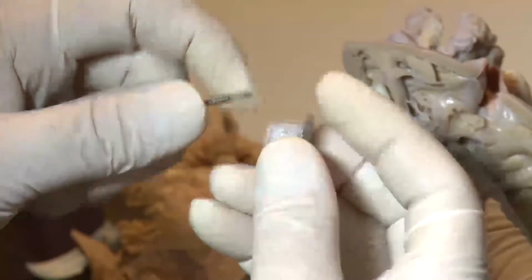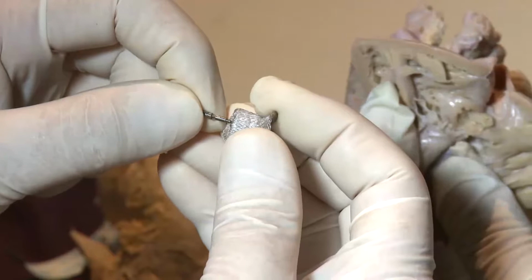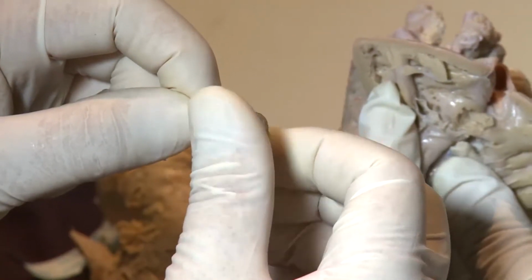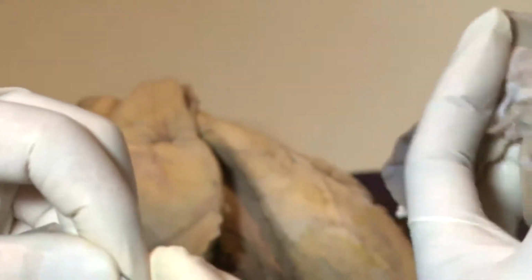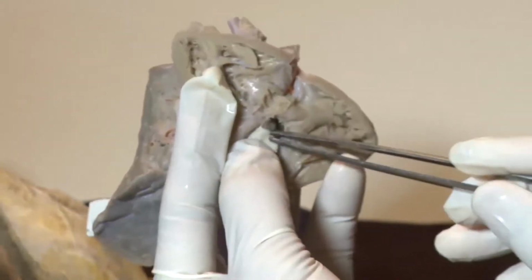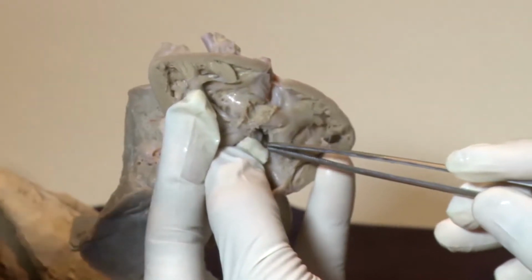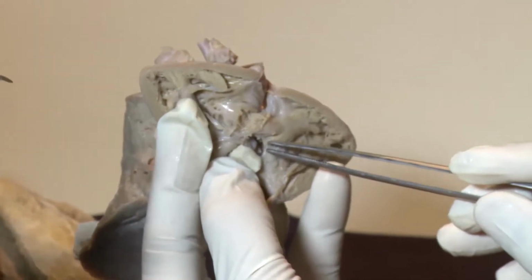So I have performed more than 30 cases of perimembranous VSD closure with ADO1. But what we should consider is that we may damage the conduction axis from the left side, but we are not suturing this margin, we are attaching something on it.